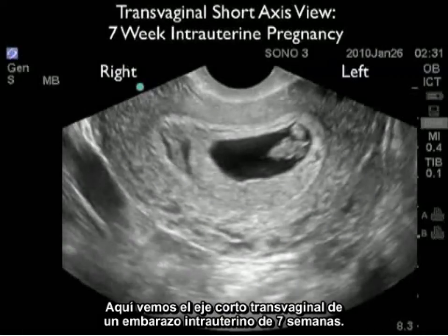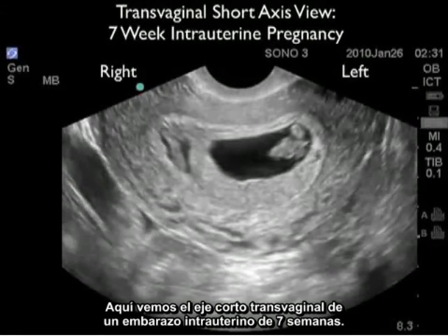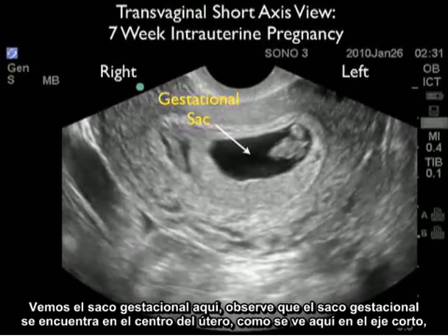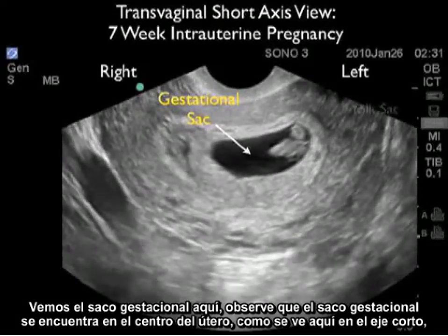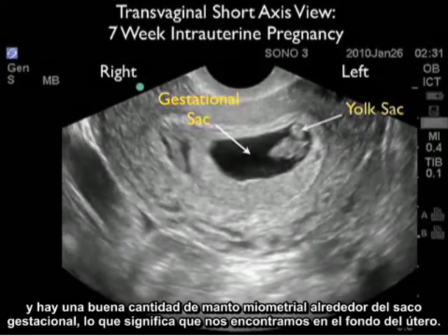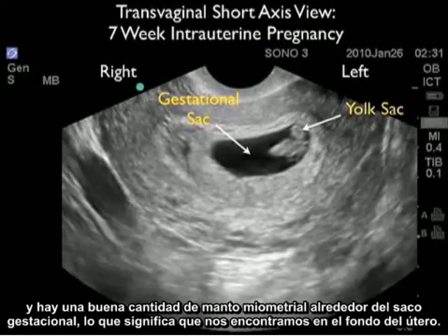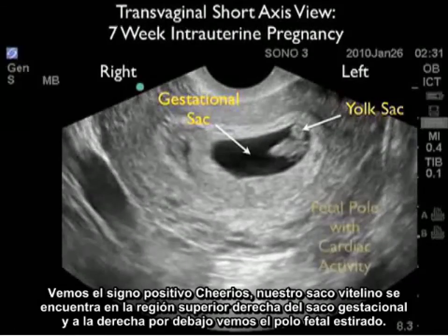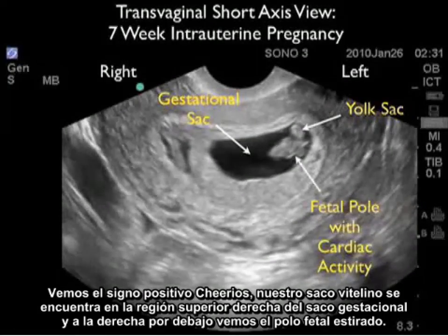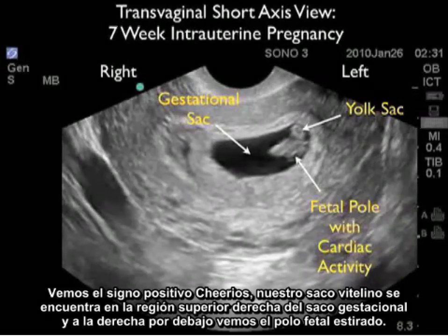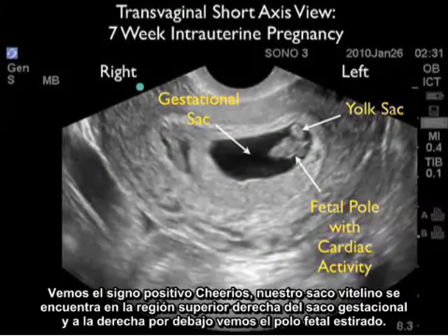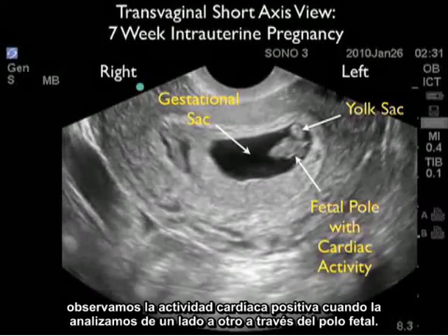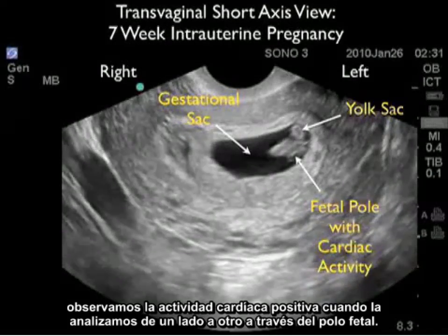Here's a transvaginal short axis view of a 7-week intrauterine pregnancy. The gestational sac is located in the center of the uterus as seen in short axis, with a good amount of myometrial mantle surrounding it, signifying a fundal location. We see the positive cheerio sign or yolk sac to the upper right aspect of the gestational sac, and right below we see the fetal pole stretched out. Notice the positive cardiac activity as we scan back and forth through the fetal pole.